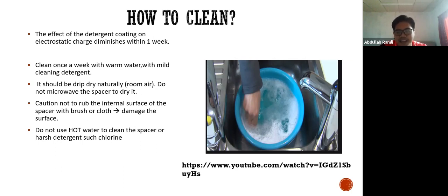Okay, so that is the importance of cleaning the spacer that I want to convey here. So what you can do is clean it once a week with warm water and mild cleaning detergent. Then it should be dried naturally in room air.